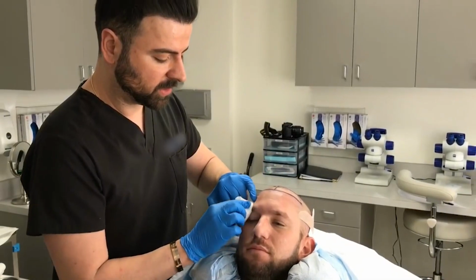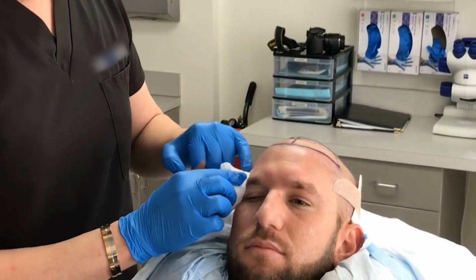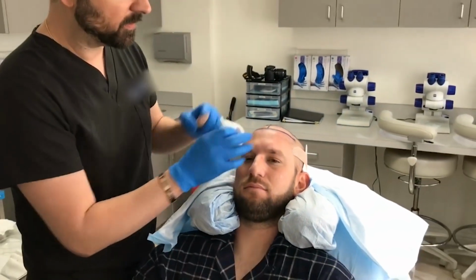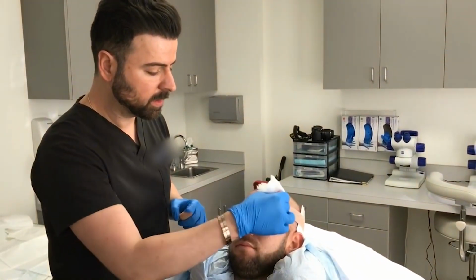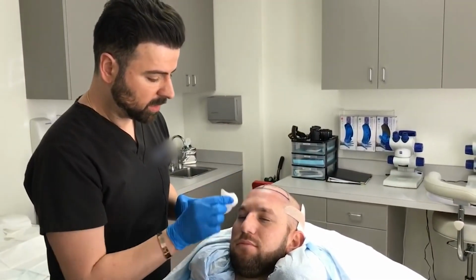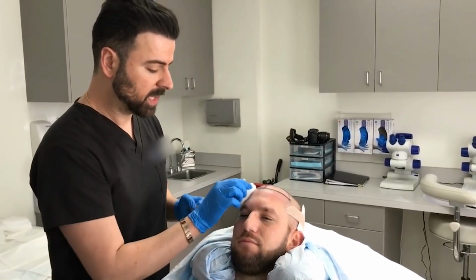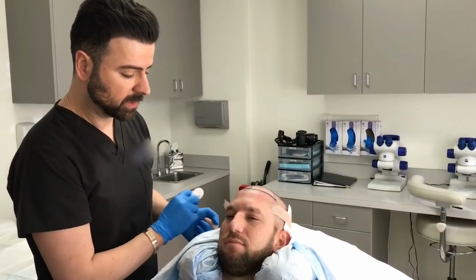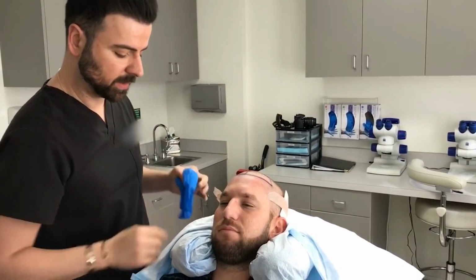All right, Chad, we just finished the nerve block for you, okay? So what we're going to do next is work on the incisions, which are basically the new homes for the new grafts that we harvested earlier, okay? So your forehead right now is going to start feeling very heavy and very numb, and you shouldn't have any more needle poke pain after this phase, okay? Sounds good. Your head's going to feel heavy, it's going to go completely numb, but that's normal. It's going to be numb for about another 7 to 8 hours. All right, so we're going to transition into the incision phase next, okay? You did awesome.